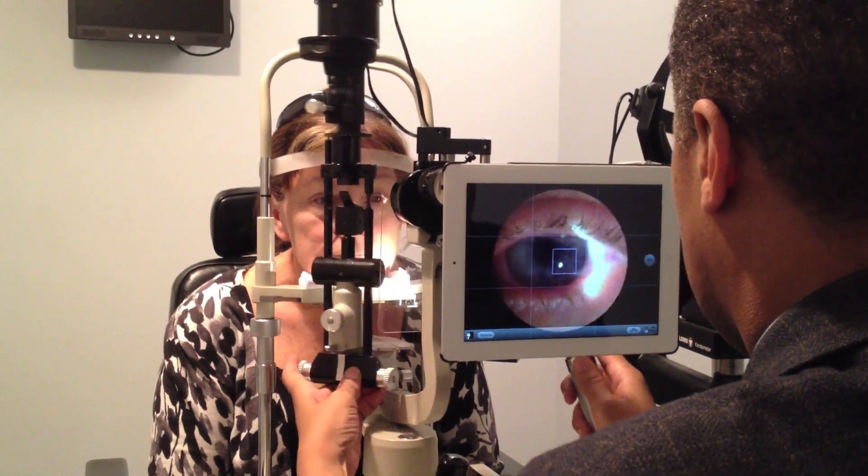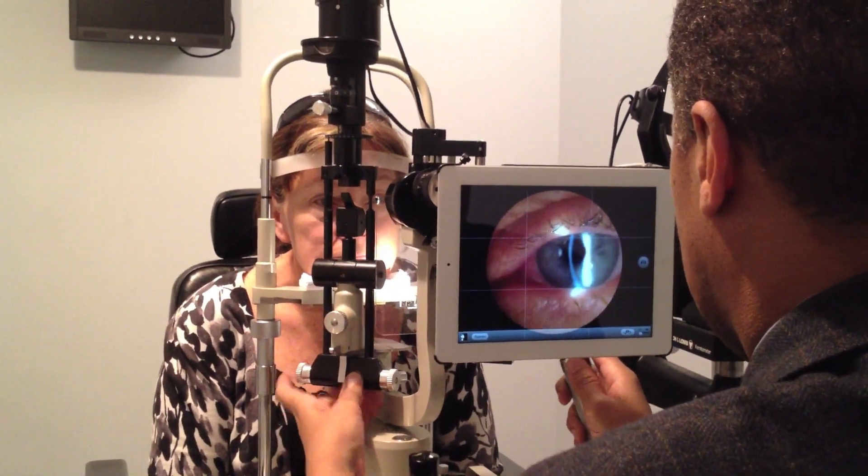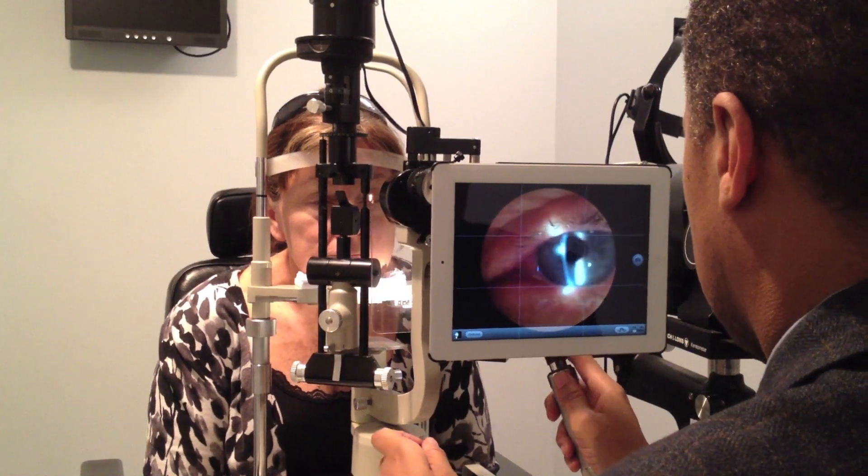He can find the right place, but it's much more cumbersome than the light I'm about to show you.